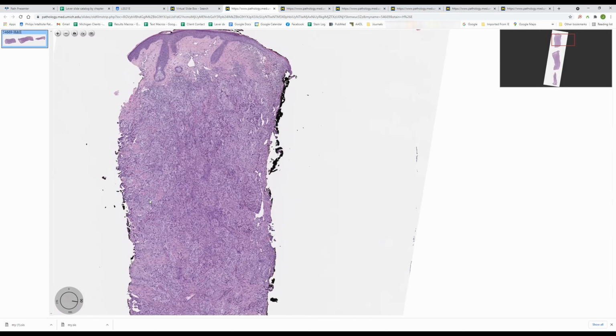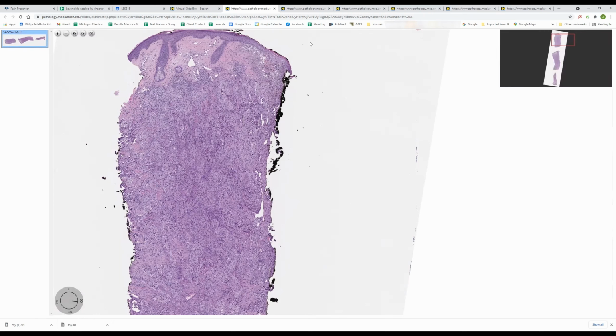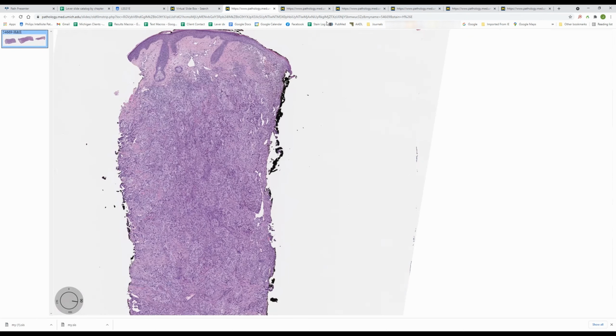And perhaps in this case, I wouldn't get the Vimentin or the LCA. But S100 is going to be your most sensitive melanocytic marker, which tends not to be lost even in desmoplastic melanoma. That would be a good panel to start with. And depending on what those markers showed, then you could go on with more specific immunohistochemistry.